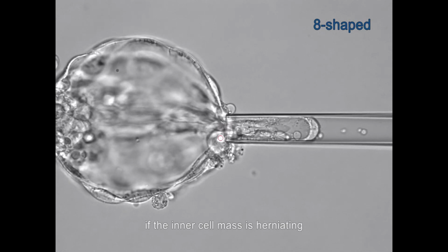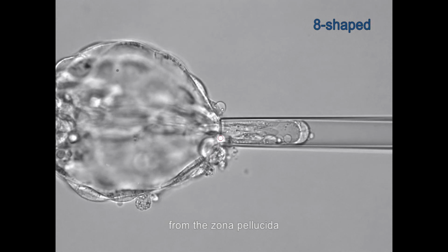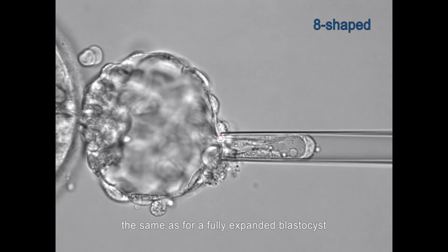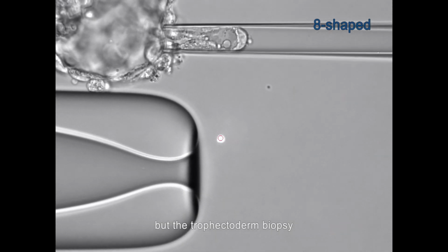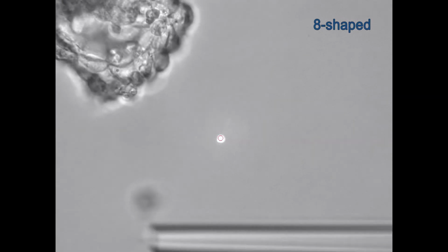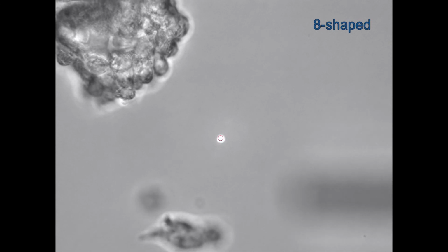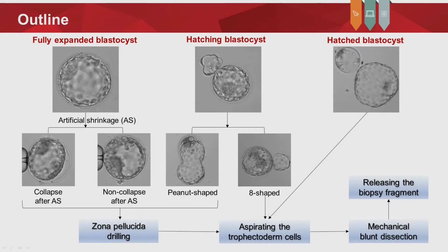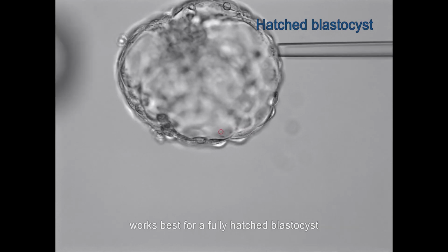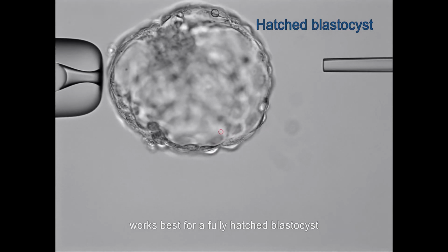Importantly, if the inner cell mass is herniating from the zona pellucida, the biopsy method remains the same as for a fully expanded blastocyst, but the trophectoderm biopsy should be performed away from the inner cell mass. In the last part, the biopsy method for hatched blastocyst is demonstrated. It is worth noting that the mechanical blunt dissection works best for a fully hatched blastocyst.